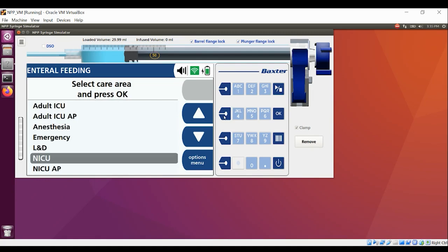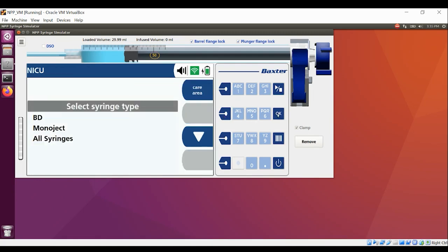We're going to go ahead and start setting this up for a weight-based continuous infusion. Want to point out a little bit of a change. You'll see Monoject, when we go to load it, we no longer have to select the flange type. That's because Monoject doesn't have different flange types, and it's not important for us to do that anymore.